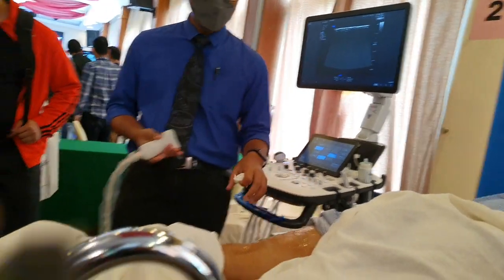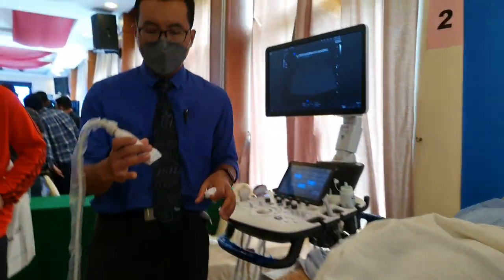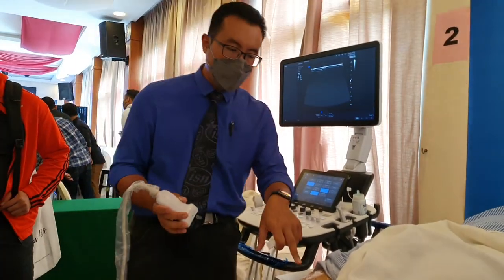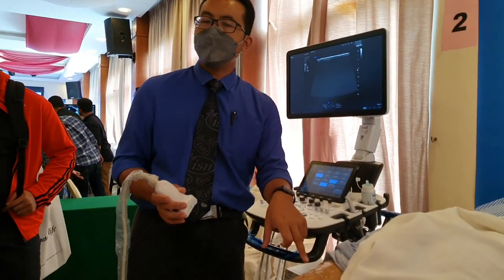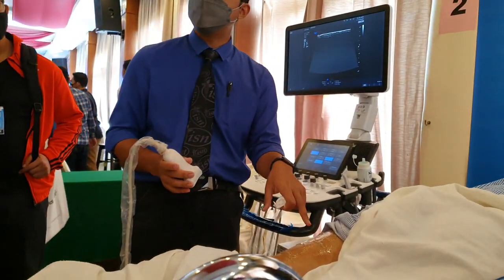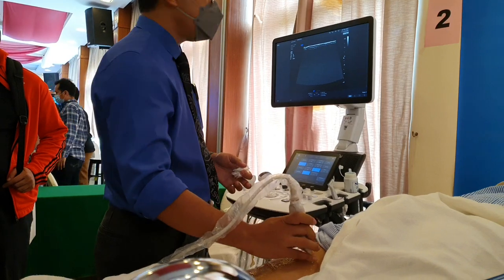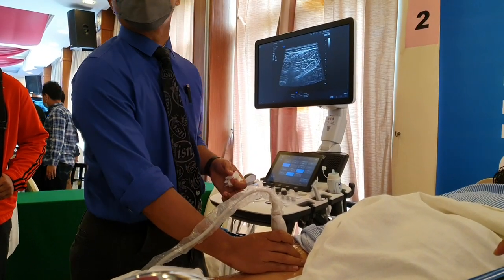Painful area. So we don't start from the origin or from the attachment. Okay, we are wasting our time. So let's say this area is painful, and then you see bruising and so on, clinically suggestive of hamstring tear. So you just start from there, you put the probe.